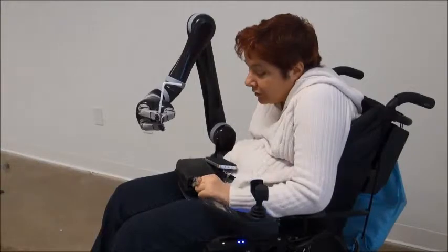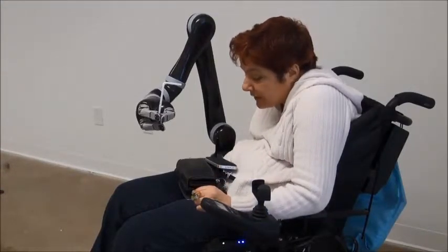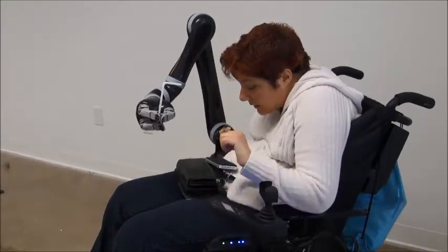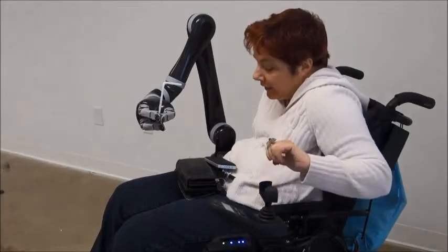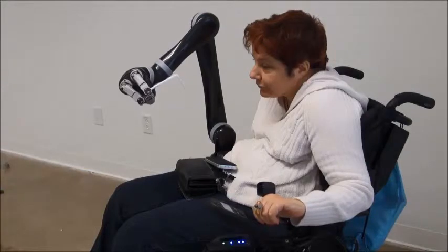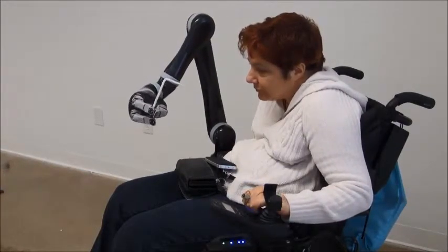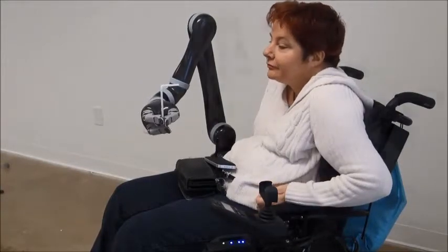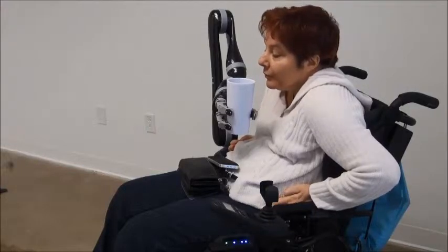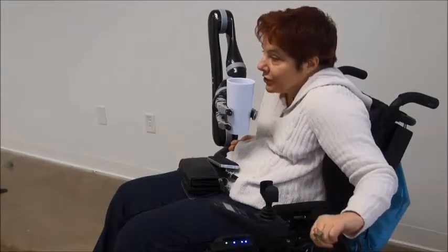Now I can hold the mode button for 5 seconds and show you the difference in the movement. Now that I have demonstrated with a straw, we'll show you with a glass the difference with the drinking mode.